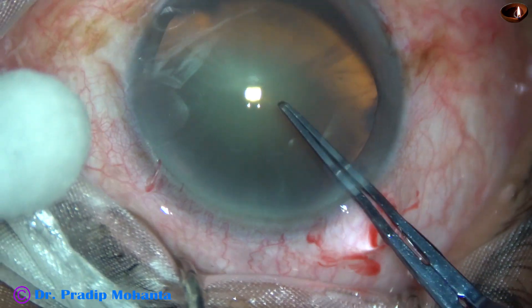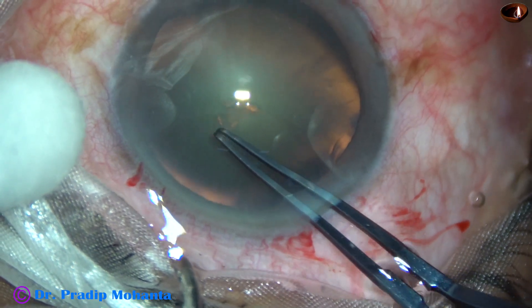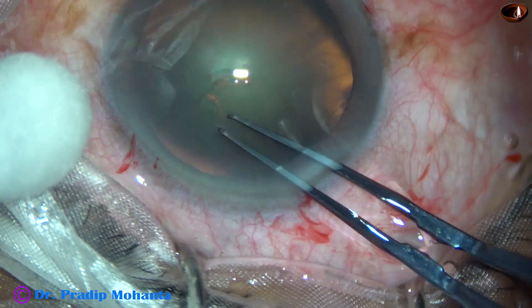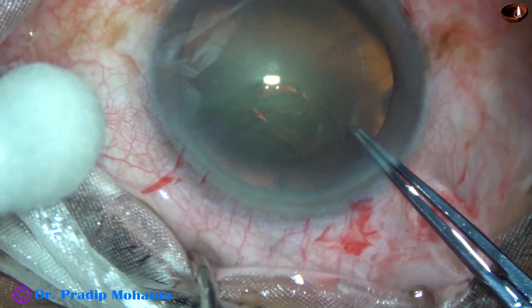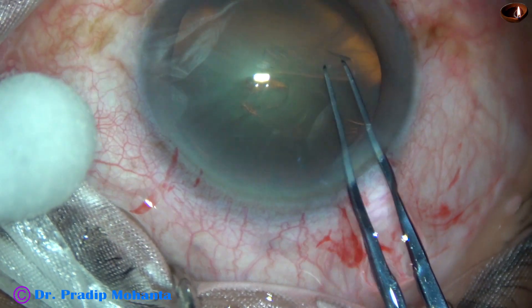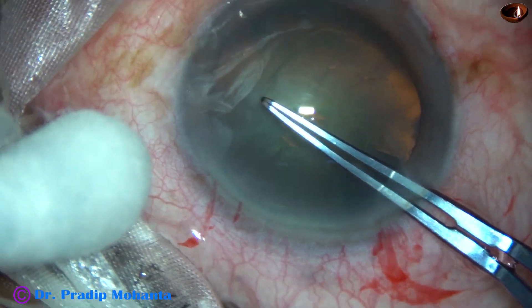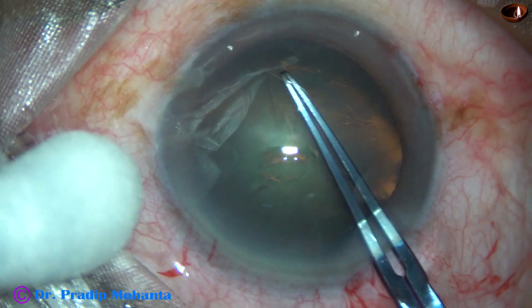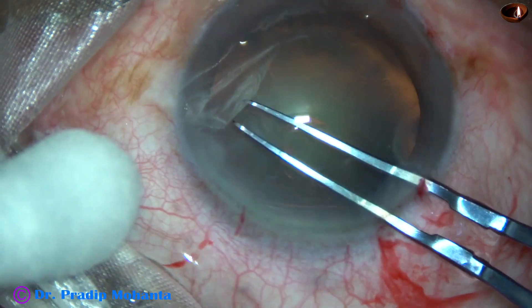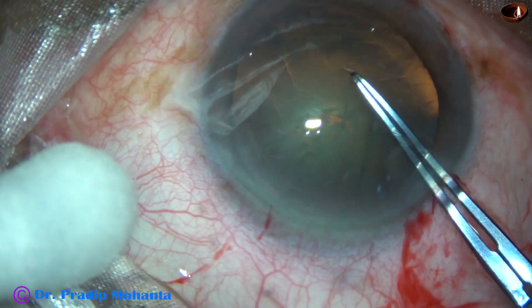And now, the rhexis is with Utrata forceps. The capsular tag is raised. The capsular tag is held with the forceps and the tag is guided anticlockwise all around, remaining at a certain distance away from the margin of the dilated pupil. And thus, an adequate sized rhexis is done.